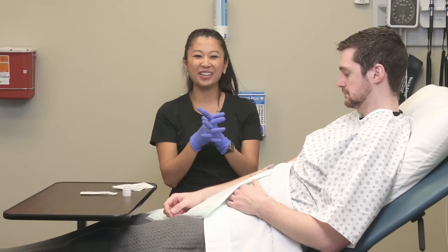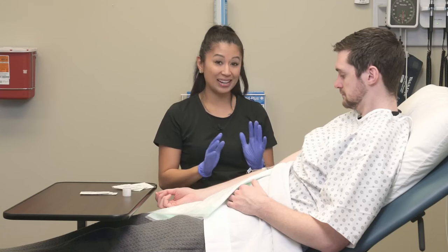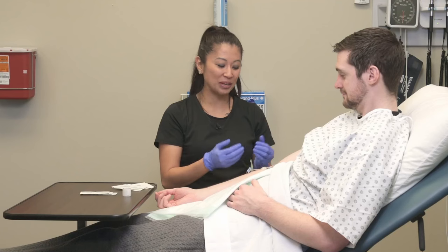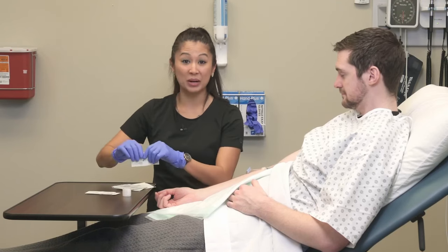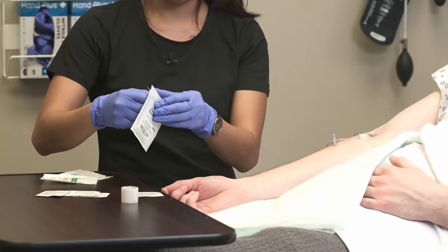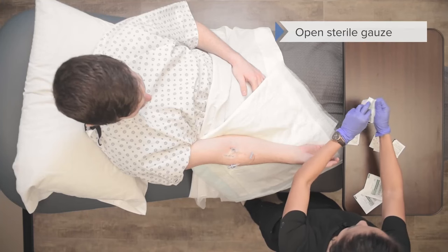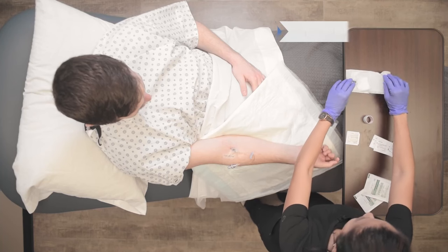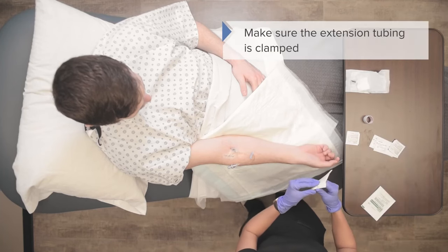Now that I've got my gloves on, make sure you explain the procedure to the patient. If you have a male patient, sometimes try to be gentle because this may pull on some arm hair. Go ahead and open up your gauze pad and have it ready. Sometimes patients may bleed a little more than others, so you may want more than one gauze pad.